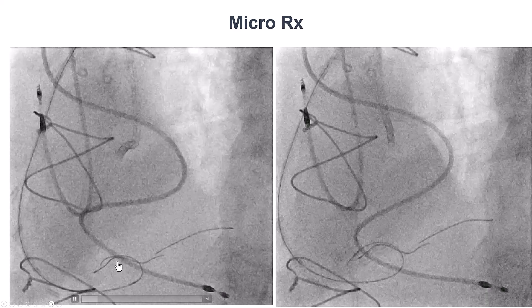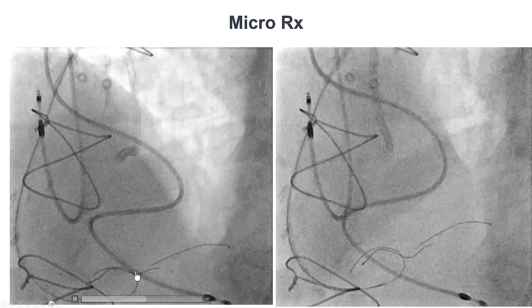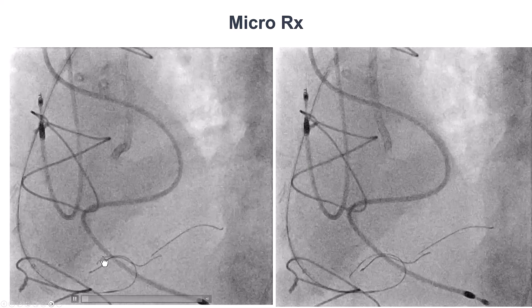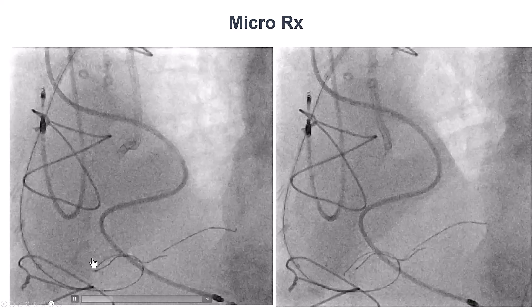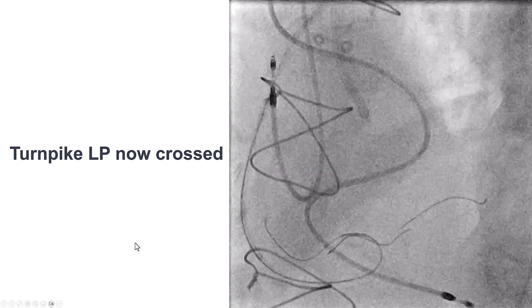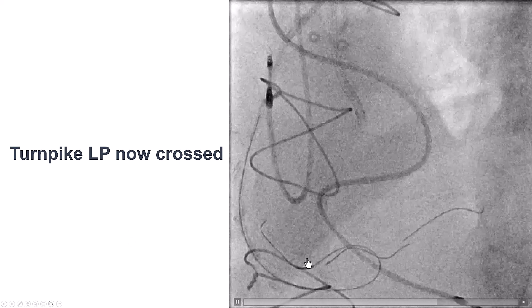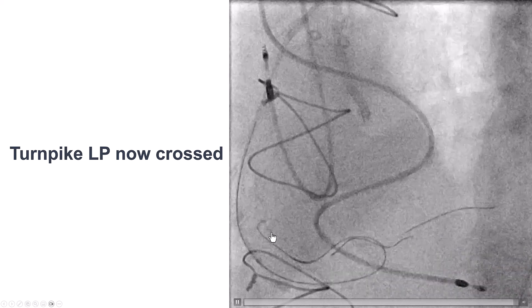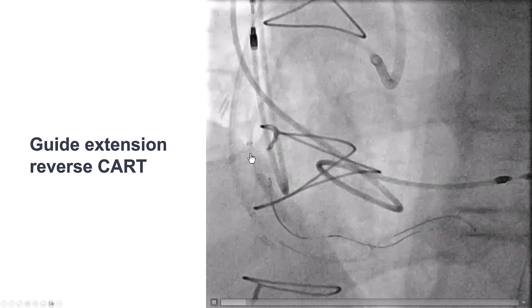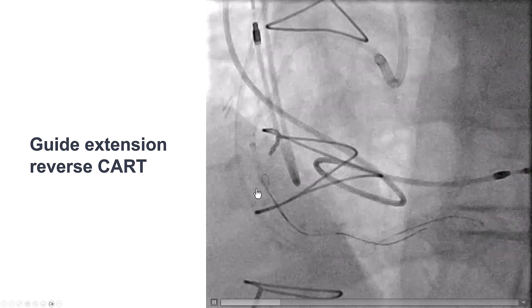We tried the MicroRx and, to our pleasant surprise, it crossed relatively easily. We can see it crossing through the distal RCA into the distal portion. After that, the Turnpike LP also successfully crossed into the distal RCA. We now had overlapping antegrade and retrograde guide wires. We advanced a guide extension to the mid-RCA and performed a guide extension reverse CART.